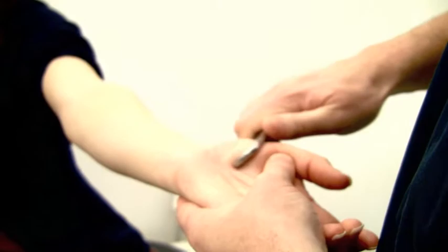So Stephanie came in today and she complains of wrist pain, and also she has constant headaches. So for the wrist, we did a number of treatment therapies. We utilized chiropractic manipulation to the joints. We used Graston Technique to help break up some of the tissues. We used electric stim with heat to warm them up before we do the Graston. We also use something called kinesio tape.